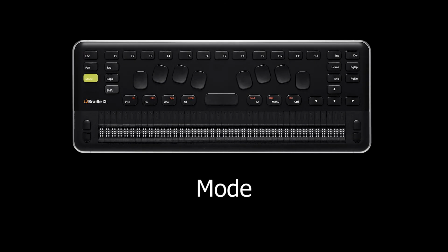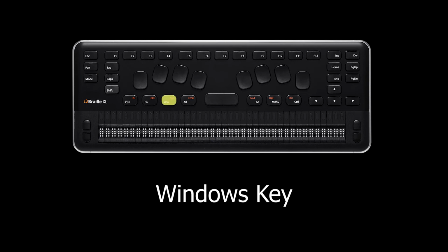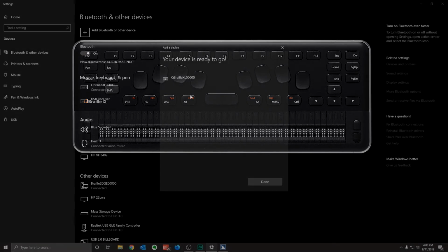To do this, I'll just hit the Mode button on the QBraille, and I'll get a Braille notification that hybrid mode has been turned on. I could test if hybrid mode is turned on by hitting the Windows key on my QBraille, and if the Start menu pops up, that means hybrid mode is working and my QBraille is ready to go.